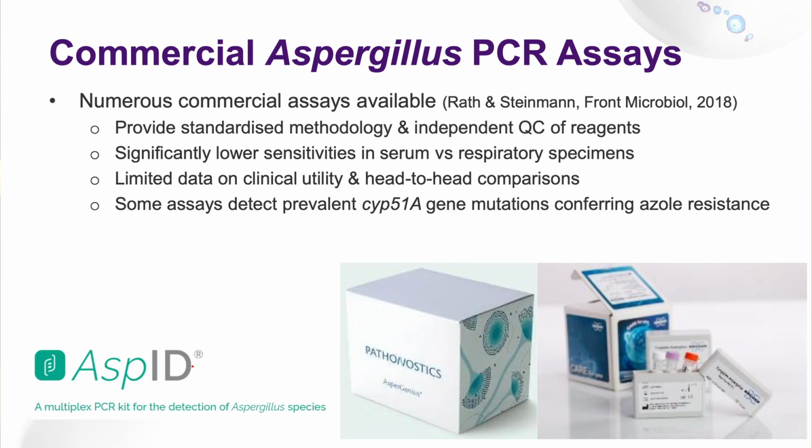So over the last probably 5 to 10 years, we've seen quite a few commercial assays being developed for Aspergillus, and these provide standardised methodologies and they perform independent QC of reagents. That's been one of the limitations before, is that we've got a lot of Aspergillus in the environment, so our reagents can become contaminated. They don't have as good sensitivities in serum compared with respiratory specimens, and there's relatively little data on their performance in proper clinical studies.